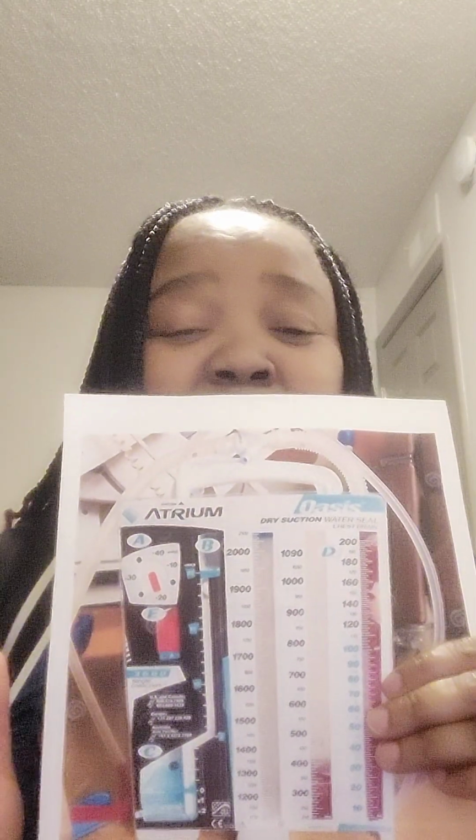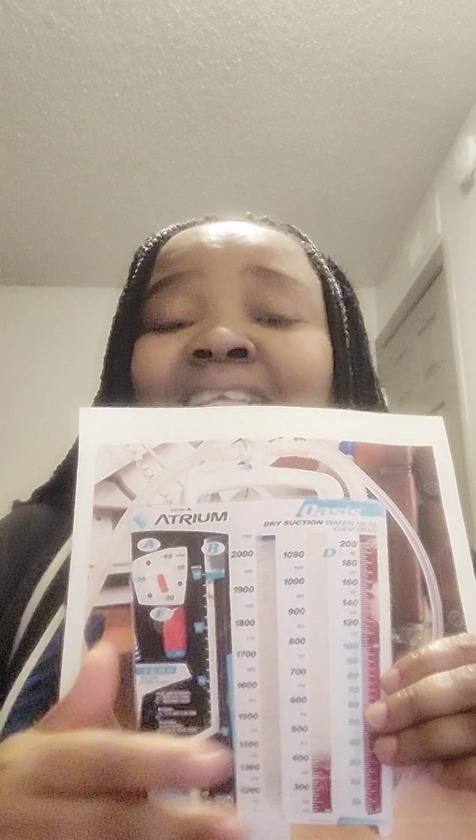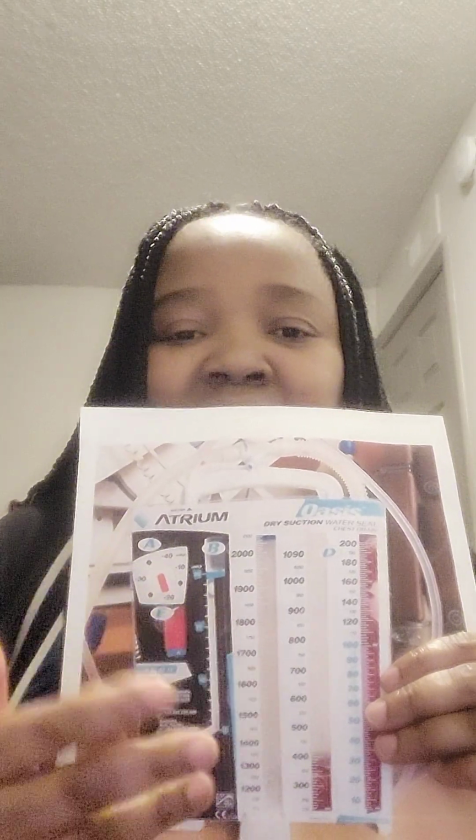Then another thing to take note of, the leak we're talking about may be inside the patient, that's the pleural space, or outside the patient, that's within the tubing, from the chest tube coming out of the patient to the tube that connects it to the system. So that is where the leak may be originating from.